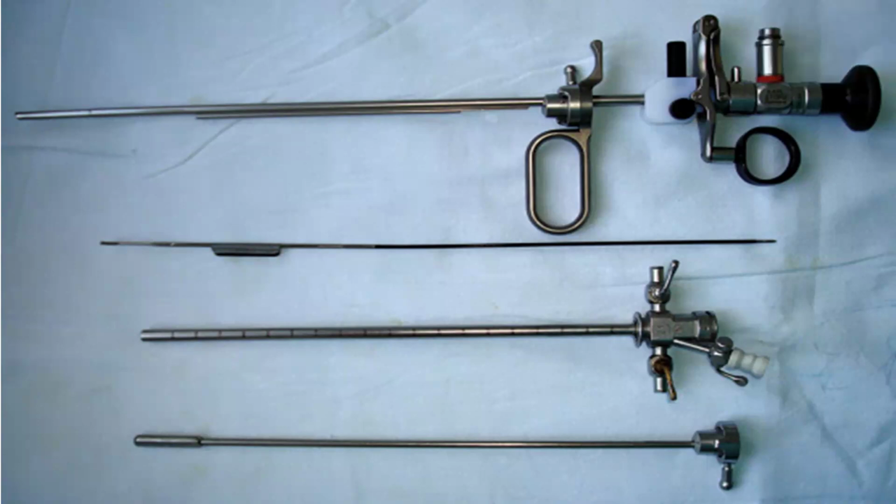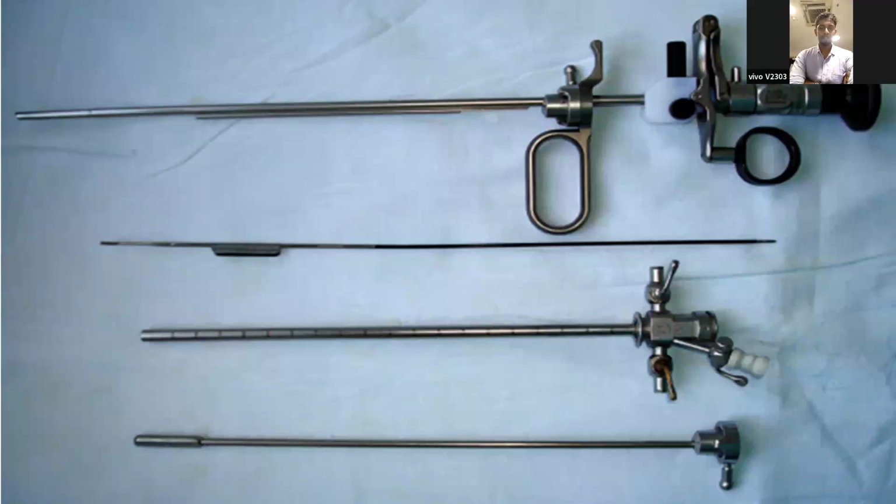Now tell us something about the working element. It is a passive working element, sir. Thumb operated, which has a telescope assembled along with it, sir. In this, the blade will remain inside the sheath.